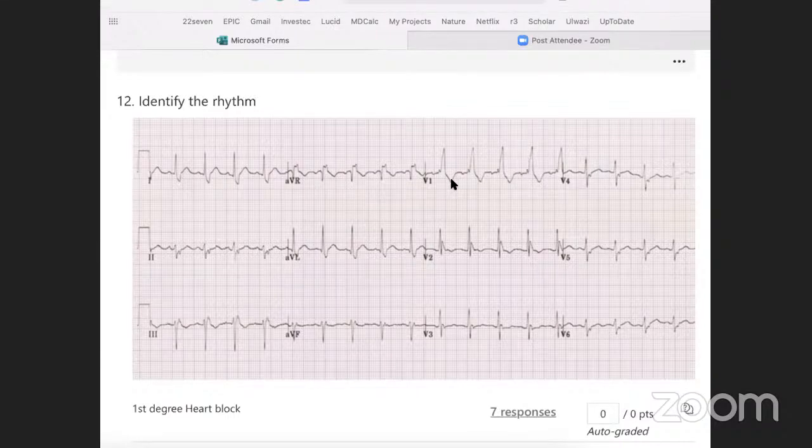A key learning point from this ECG I spoke to earlier was that a right bundle branch block on its own should never produce axis deviation. Here my right hand is pointing down in aVF while my left hand is pointing up in lead 1. And so I have a left axis deviation in the presence of a right bundle branch block.